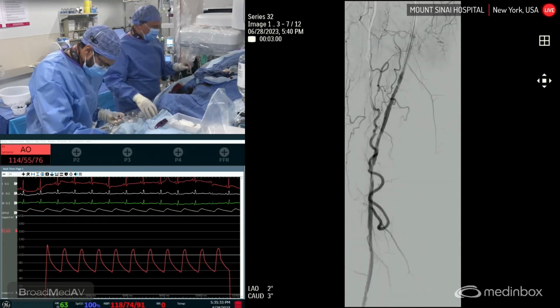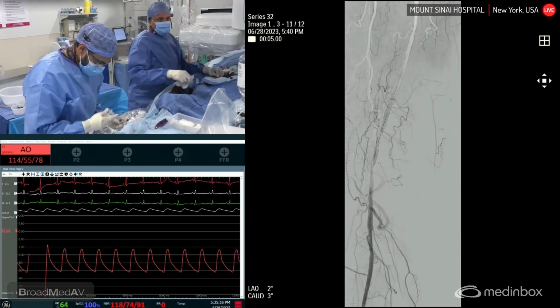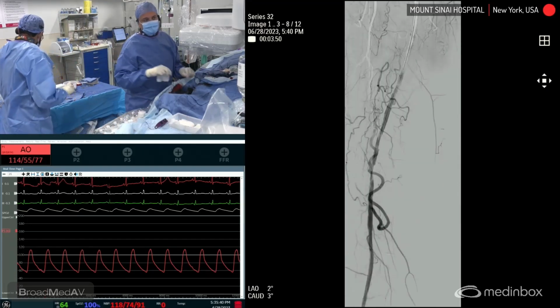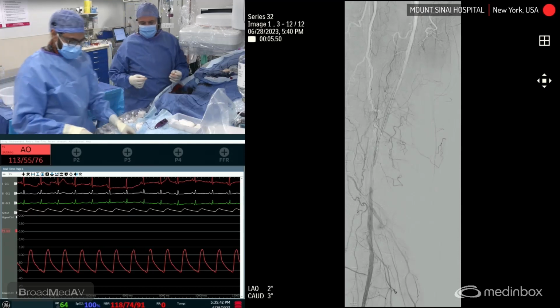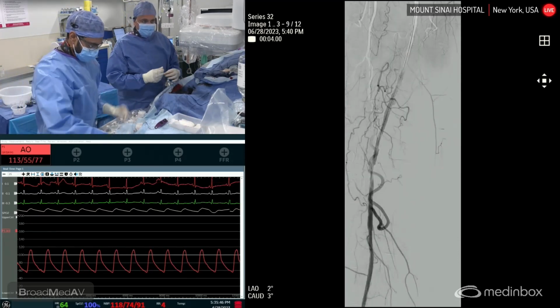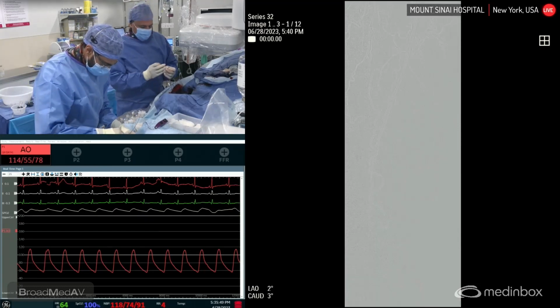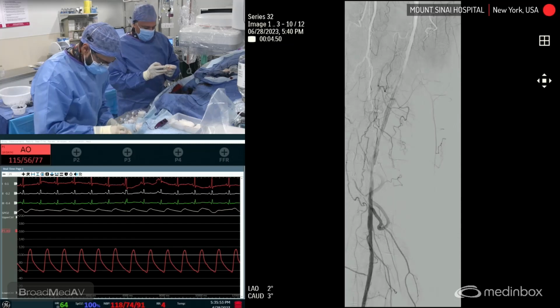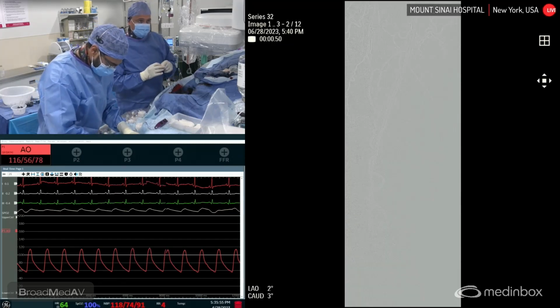I know Dr. Ali, you had talked to me about doing a DCB and necessarily spot stenting. So we'll figure that out with this right now. Remember the IMPACT Long registry. There was a 40% spot stent rate in those lesions, and the TLR rates were low for 25 centimeter lesions. So therefore, it does seem to work.